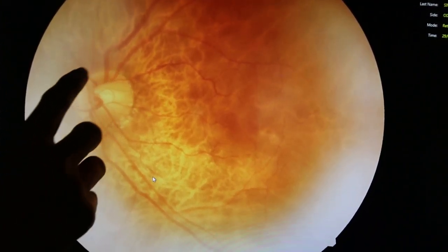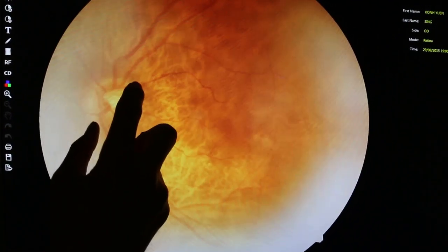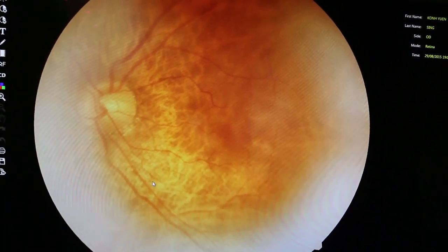What you need to know is that you find the disc and the cup. This is the disc, and the little thing is the cup. So your disc is 1.0, your cup is 0.2, meaning that at this point of time you do not have any problems with glaucoma.